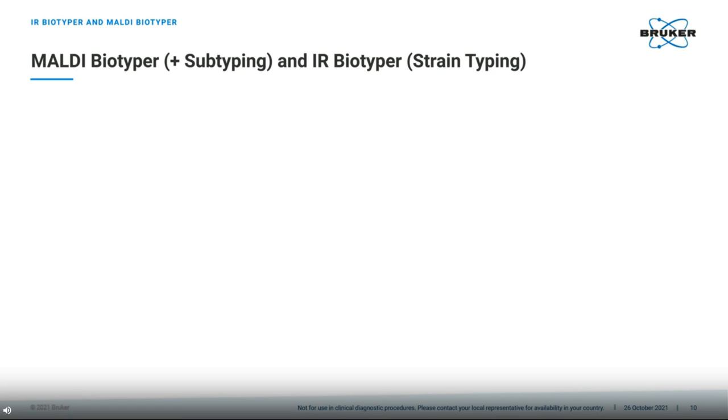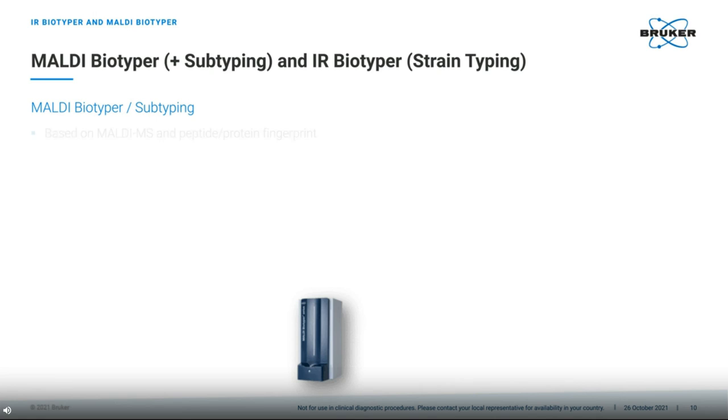What is now the difference between the MALDI Biotyper, subtyping, and the IR Biotyper? I think you have heard about these products. What are these different products doing? The MALDI Biotyper and subtyping are based on MALDI-TOF, time of flight, mass spectrometry. It uses peptide and protein fingerprints, a very stable and robust technology, and nowadays the gold standard in microorganism identification at the species level.